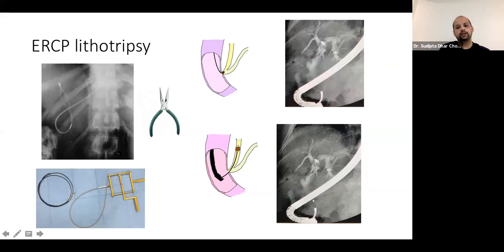Using the plier, we cut the distal end or the handle of the basket, and we feed the lithotripter over tube. We feed it over the basket wires. Through the scope, this is passed into the bile duct, and then the stone is crushed against the lithotripter by cranking the Soehendra lithotripter.